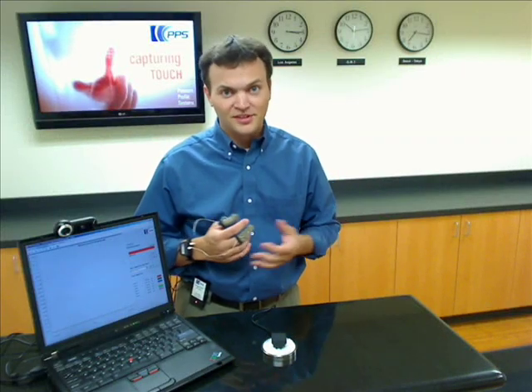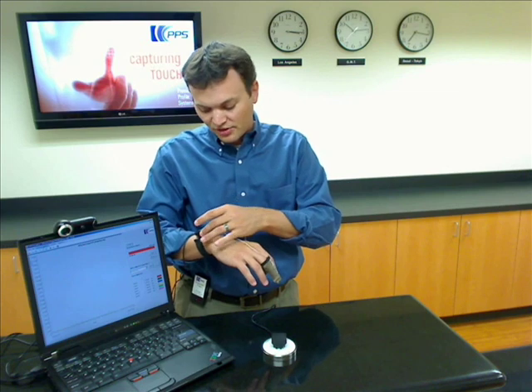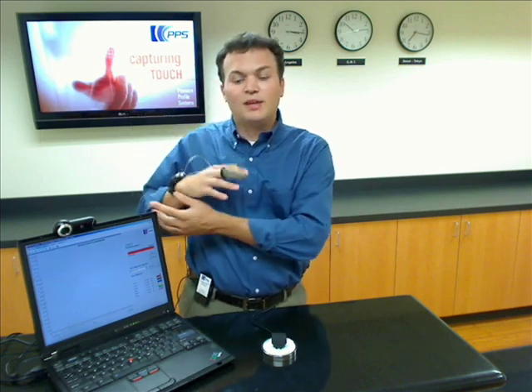Now let's set up and calibrate a fingertip system to see how easy it really is. I'm wearing two fingertip systems on the thumb and middle finger of my right hand, and I've plugged them into two of the available channels on the wrist unit. I have the Bluetooth interface module clipped to my belt, and I use these clips to keep the cables out of my way.